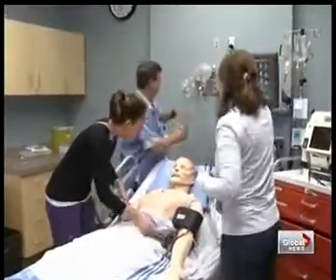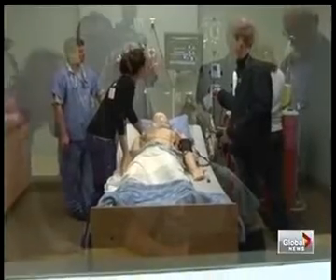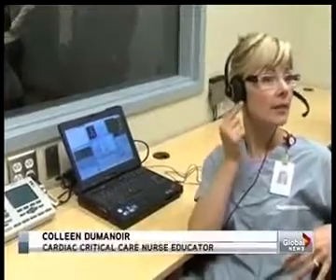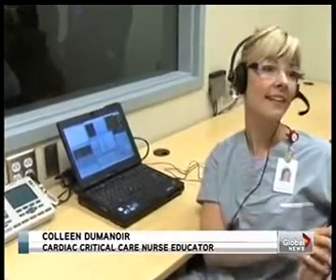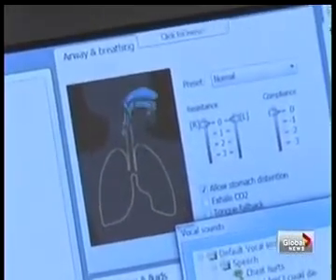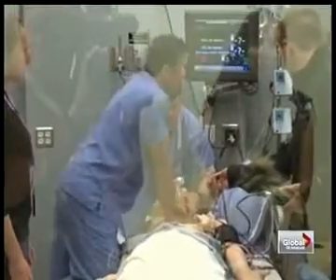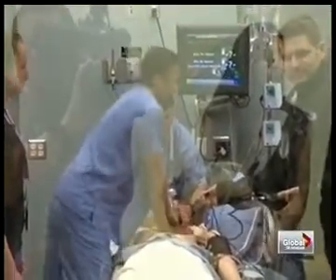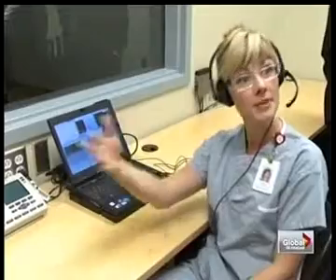This is Sam, one of 2 mock patients unveiled today. Not only does he have a pulse and can talk, he mimics most physiological reactions of live humans. Having cerebrospinal fluid come out his ears if he has a head trauma or at his nose, he can froth at the mouth. He's controlled by computers that also assess how well he's being treated, including, for example, the quality of CPR compressions he's getting. And the high-tech learning doesn't end there. It videotapes and records the whole thing, and then we debrief afterwards, and the students can bring a memory key and take home their information and review it at any time so they can evaluate themselves over the years or over the sessions.